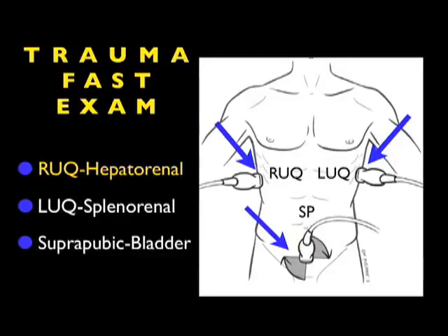So in conclusion, I'm glad I could share with you this Part 2 module on the right upper quadrant view of the trauma FAST exam. I hope now you have a better understanding on how to perform a complete exam, looking into the three areas as we discussed: infradiaphragmatic, Morison's pouch, and inferior tip of the liver. And hopefully now you'll be able to discern the presence of fresh blood versus clotted blood on bedside sonography.